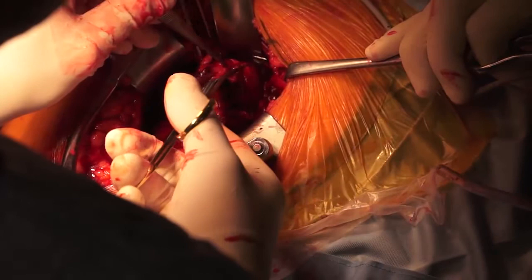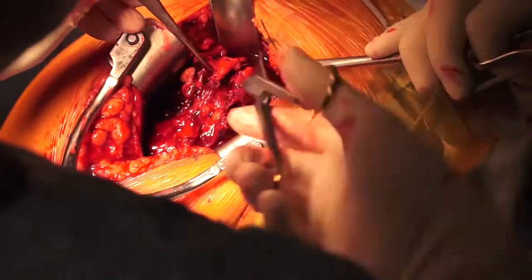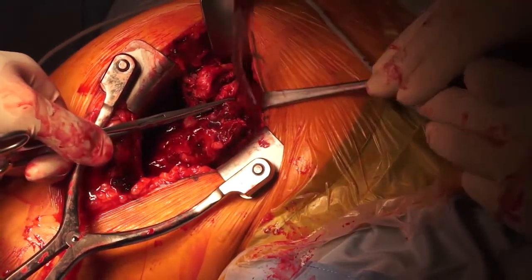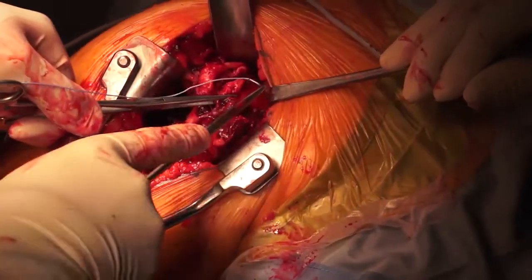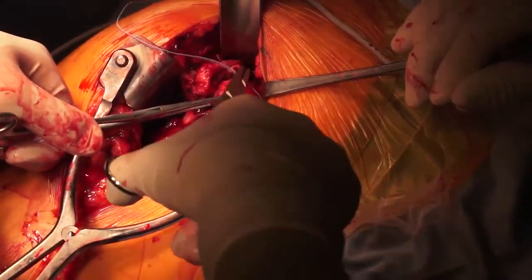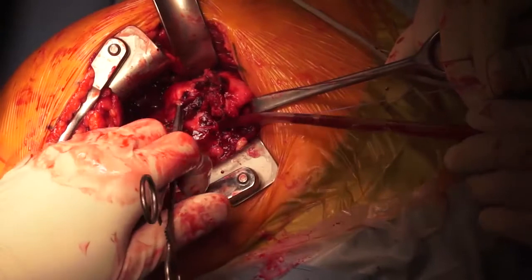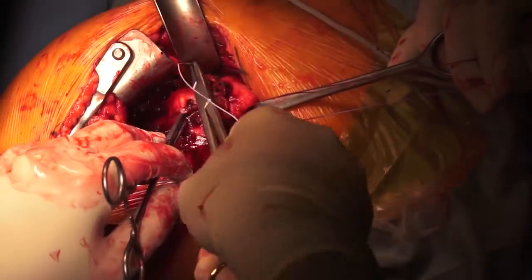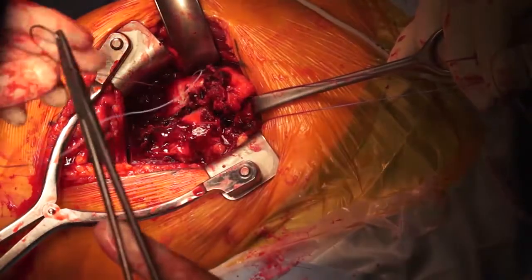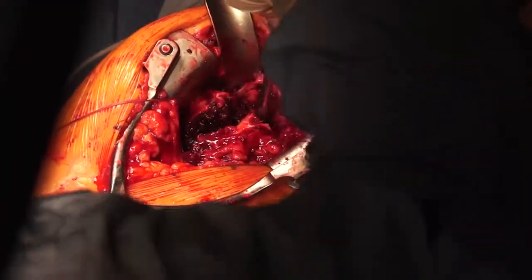Opening of the interval to mobilize the subscapular tendon. The bone tendon transition is secured with non-resorbable sutures using a modified Mason-Allen technique. In the same manner, securing the transition from the greater tuberosity to the infraspinatus tendon. The humeral head is extracted with an elevator.